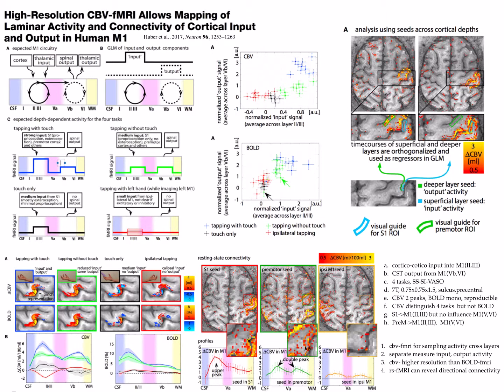So for each subject, you have 4 points on the plot, and each is colored in a different color that represents different tasks. And so from the CBV cross plot, you can clearly classify different tasks with the measured 2 peak signals. But using BOLD, you cannot differentiate between the tasks because it does not have the resolution. Especially, the BOLD signal can be influenced by the draining vein. The draining vein makes the 2 peaks disappear.